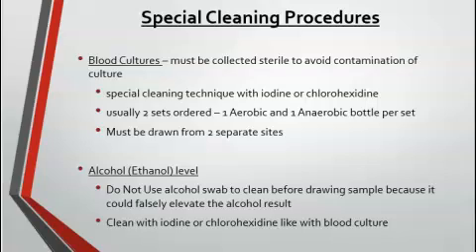For our alcohol test or ethanol test that's tested in our chemistry department, we cannot use an alcohol swab to clean before the test sample is drawn because the test sample can be contaminated with the alcohol that is used for cleaning.